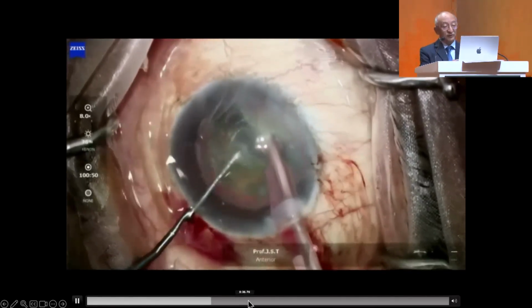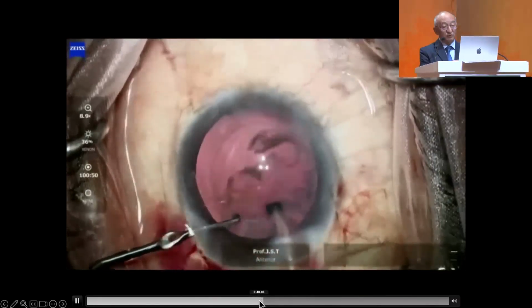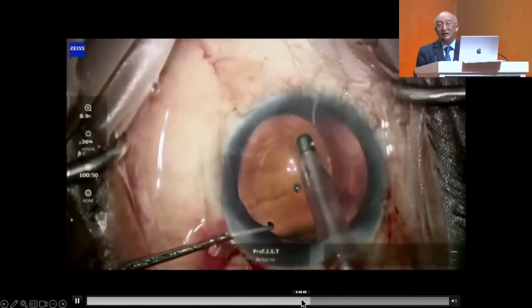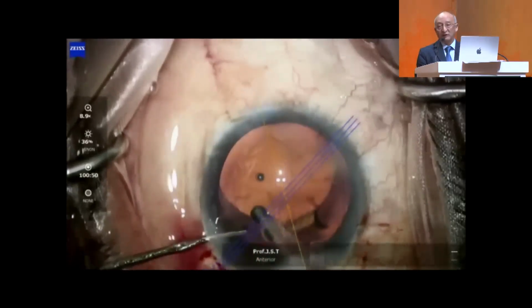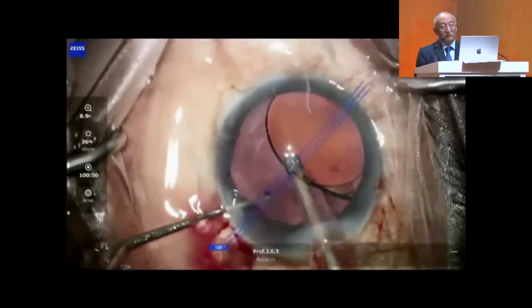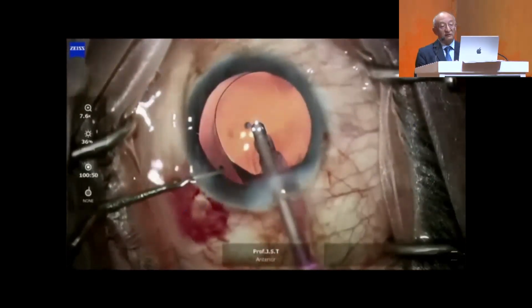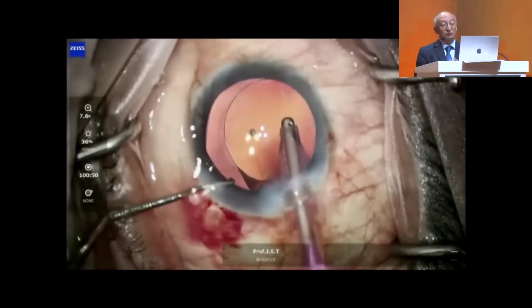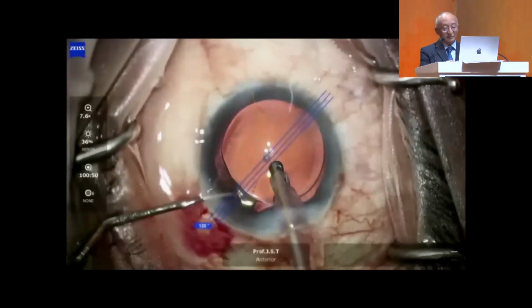Surgery should be simple so that you don't damage the posterior capsule. Once you clean the posterior capsule, implant the lens. The idea here is not to leave any viscoelastic. That is one of the important tips to take up. Go underneath the IOL, don't worry. Remove the viscoelastic, then place the lens in the desired axis and hydrate subsequently also.